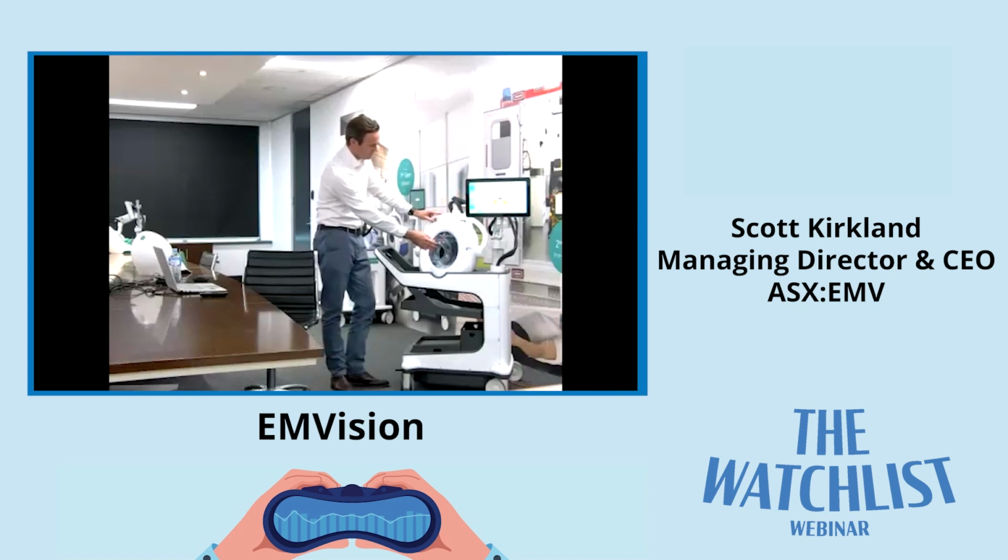And so what you'll hear now, hopefully, is the fluidic system pumping the membrane up to fill with that coupling media, which effectively removes the gap between our antennas and the head. It's as if the antennas are flush on the head. I've been scanned quite a few times, and it's relaxing. I joke it's a bit like a scalp massage at the barbershop.